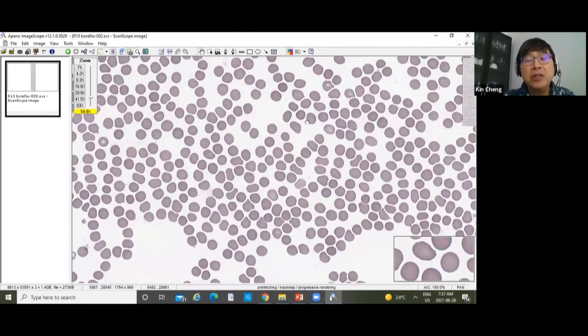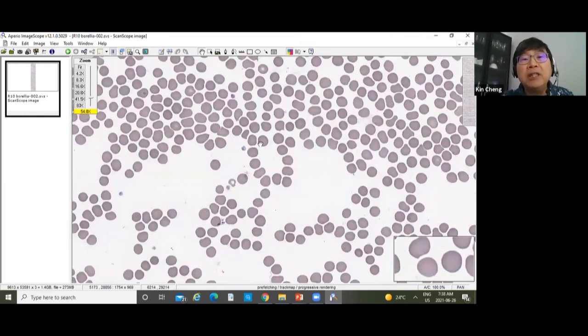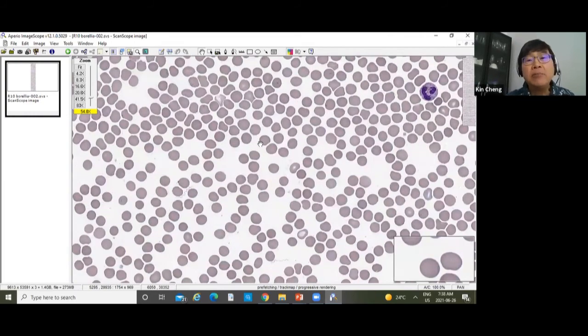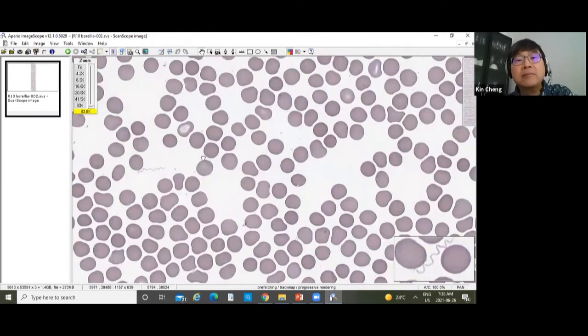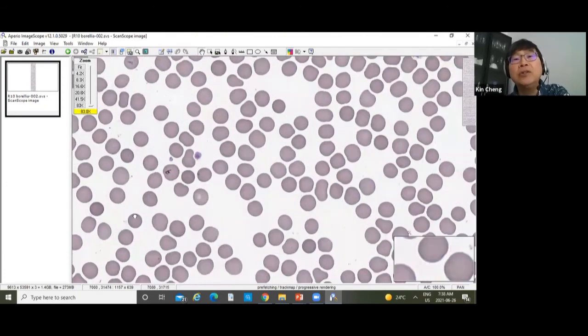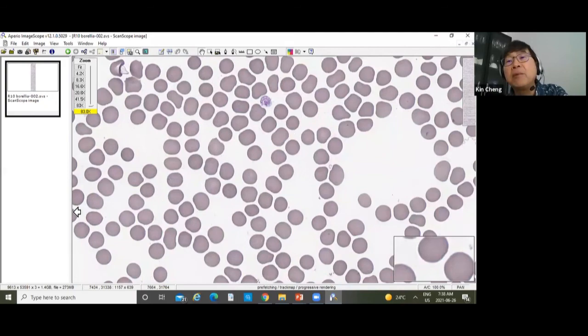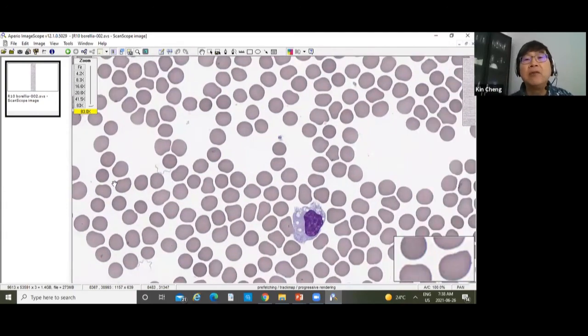There's not much to see. But again, if you are good under the microscope, then you would just move it along and look at things, right? There's not much to see, but on the other hand, you have to be vigilant when you scan. Now, I'm going to beam it up to 80 because I want to illustrate this case. This looks like there's not a whole lot to do here other than, oh, there's a lot of background noise here, right? But okay, there's a monocyte and whatnot. What else do you see?